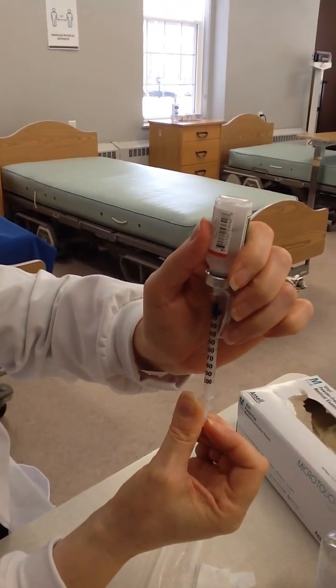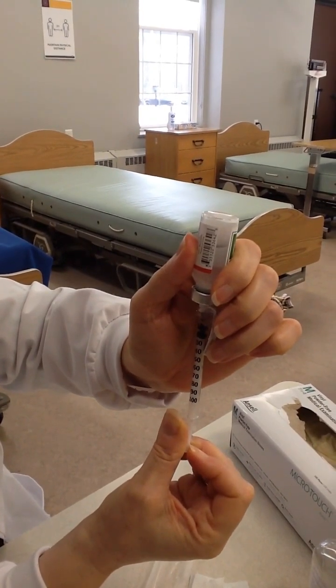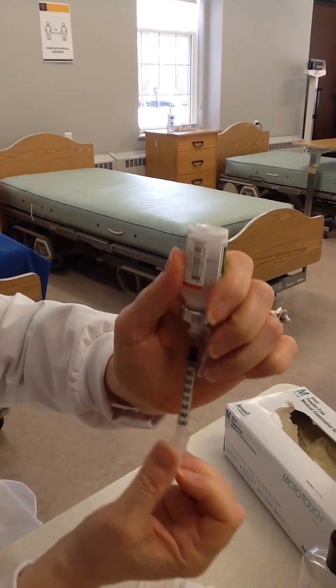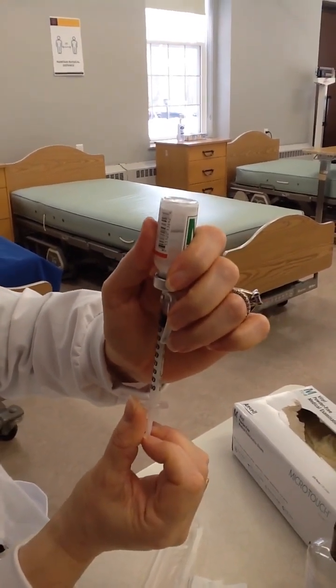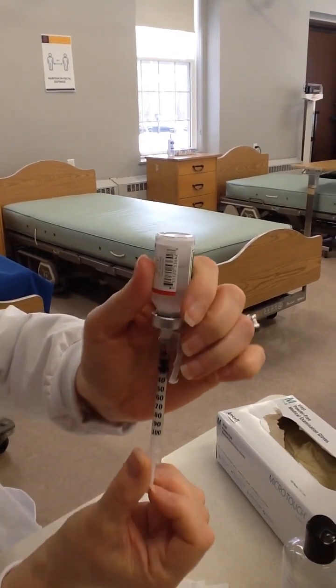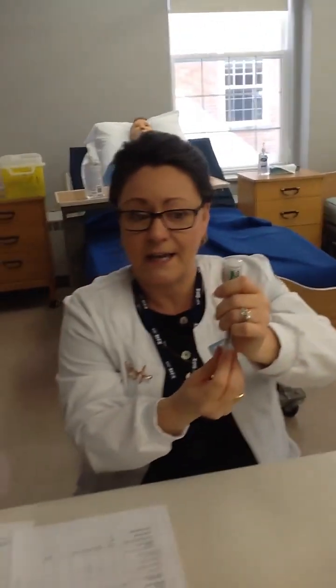Just take your time and go slow. That's how you avoid bubbles and air. And it's how you avoid overshooting. So you can see where that little 20 increment is. I'm just going to pull down nice and slow. And you can see there's 20. And so I'd get a second nurse again to check that dose for me and make sure I had 20.